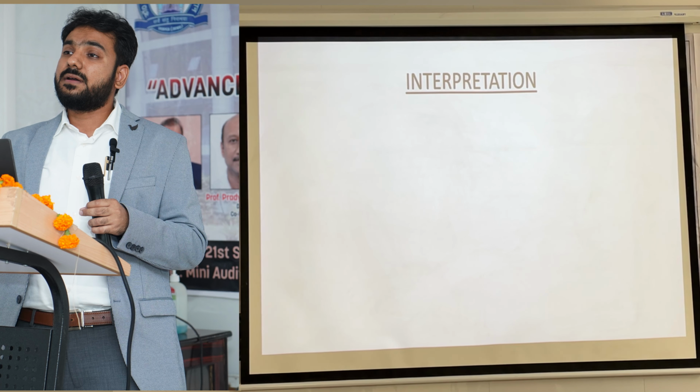Now just a quick take on interpretation. I think I have missed my time. Very quickly we will go through interpretation. What is the first step you think of DLCO? How do you start interpreting DLCO? Anyone? Look at VA, look at KCO.